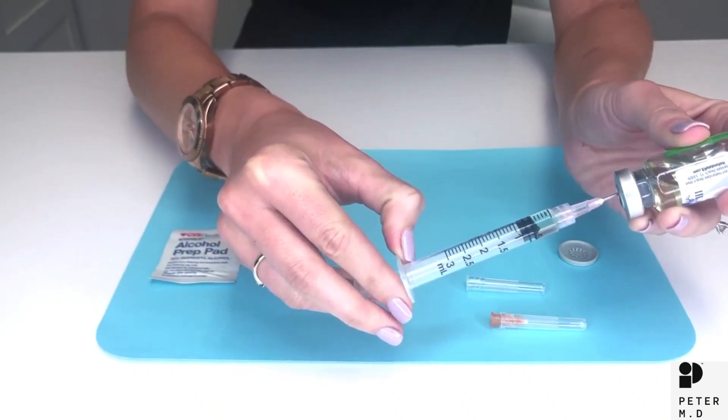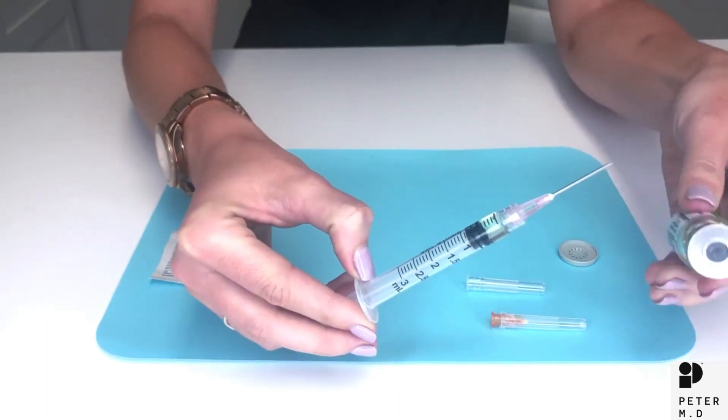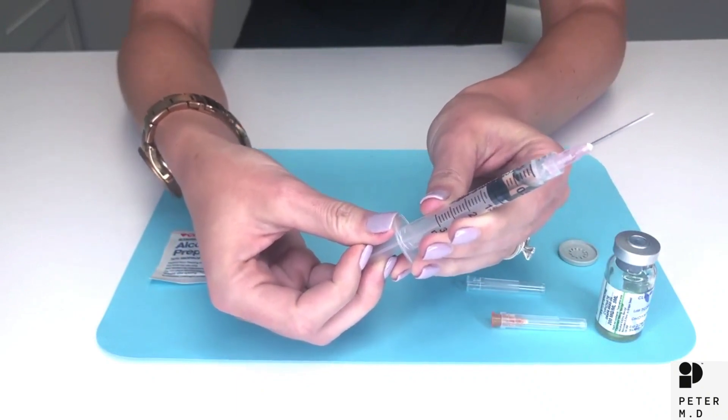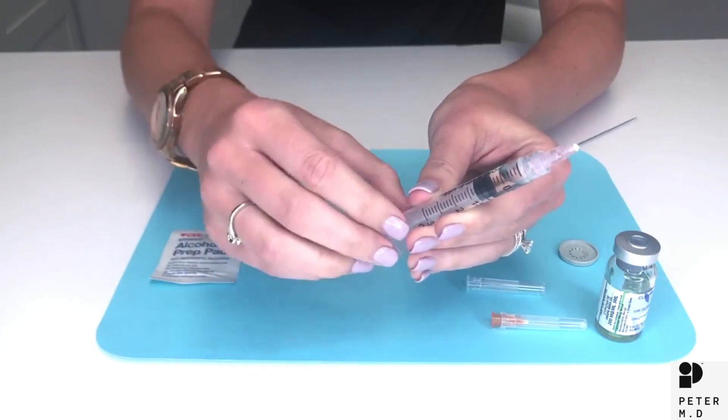You're actually going to push the plunger just slightly above that mark before you pull out. Now carefully pull back on the syringe — that will take all of the extra testosterone that was in the needle out so you're not wasting any.